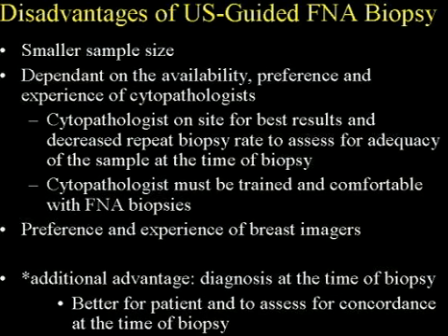The major disadvantage of this type of biopsy is that it is a much smaller sample size, so it really is all dependent on the cytopathologists that you're working with at your institution, whether they're available, whether they have experience in this type of biopsy, and what their preference is. Basically, we have a cytopathologist on site that makes sure that we have adequate results at the time of biopsy. If you don't have a cytopathologist on site, the patient may have to come back too frequently for a repeat biopsy due to inadequate sampling. Also, the cytopathologist needs to be trained and comfortable with diagnoses from FNA biopsies.